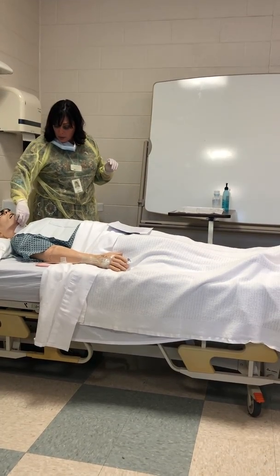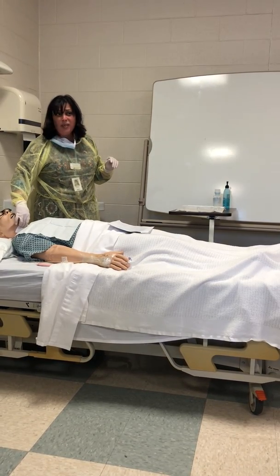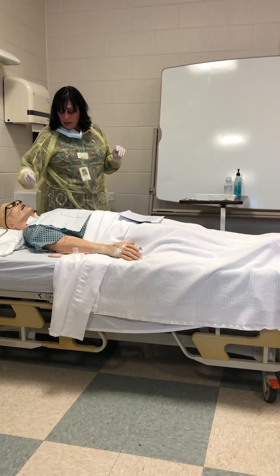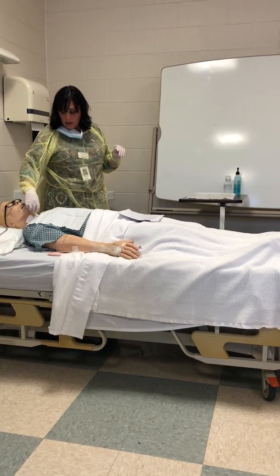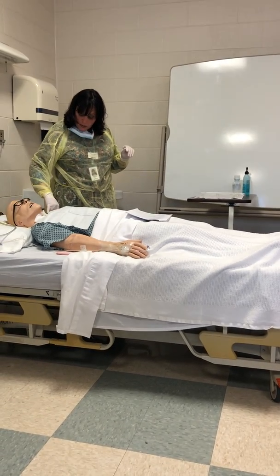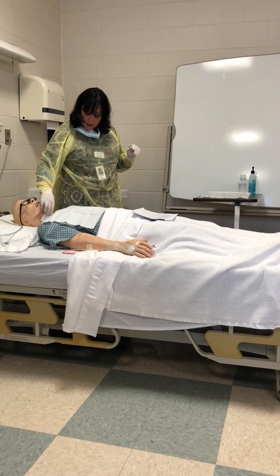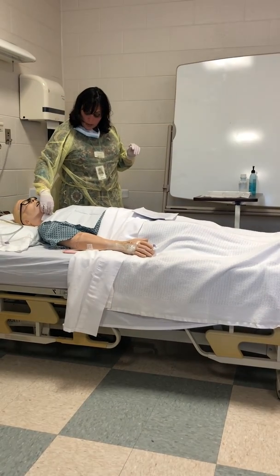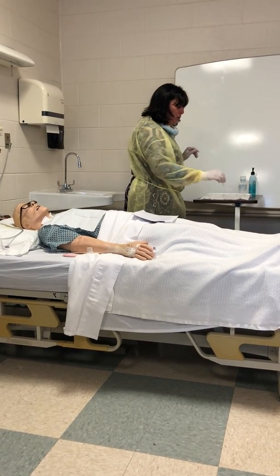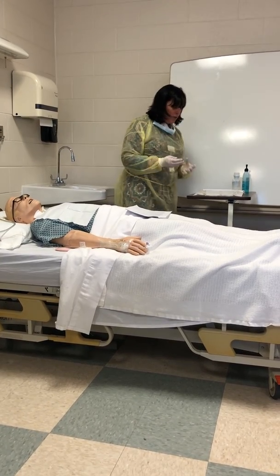Okay, so this is actually a true trach that has to be cleaned. Some of the other ones have disposable trachs. This one is actually a legit trach. So these, you'll see, they lock into place, so you have to unlock it to then be able to pull it out and slide it out. You take that, drop that down inside of your peroxide, let that soak. Okay.